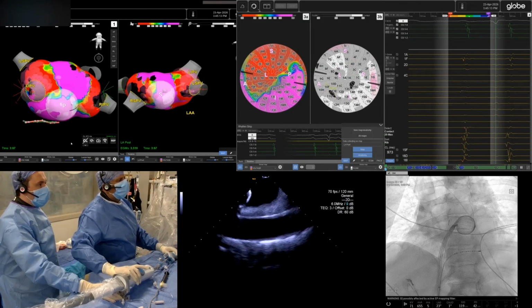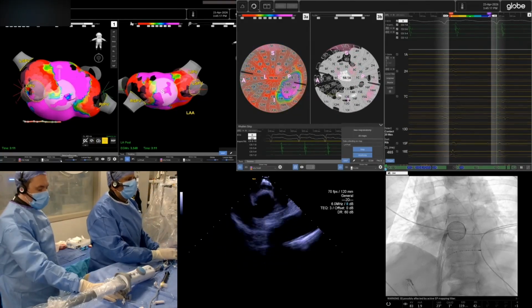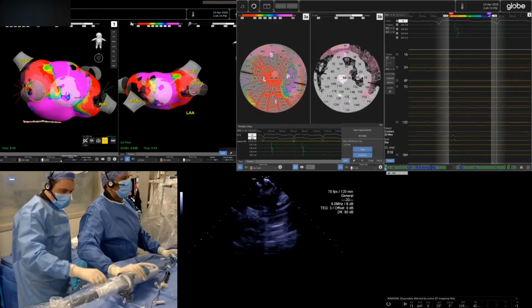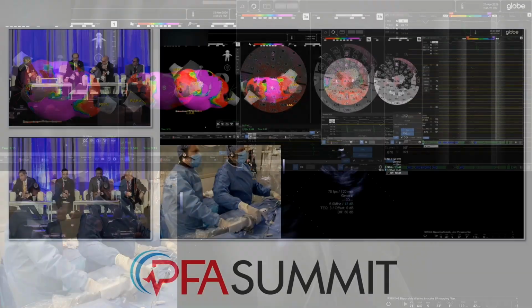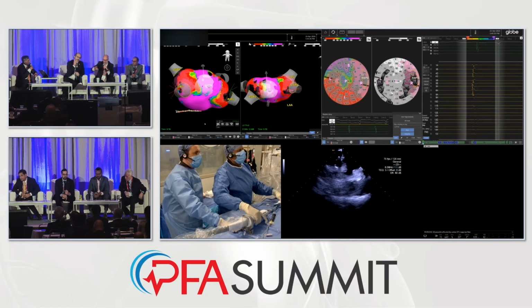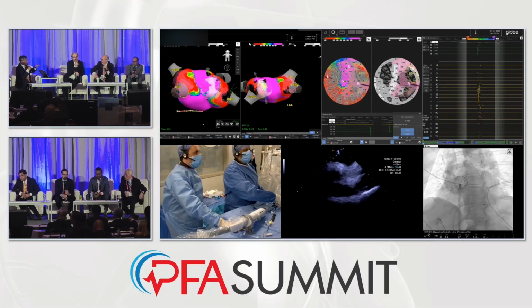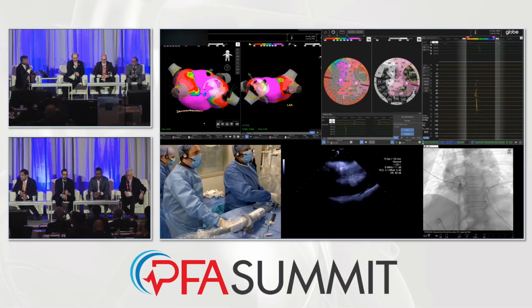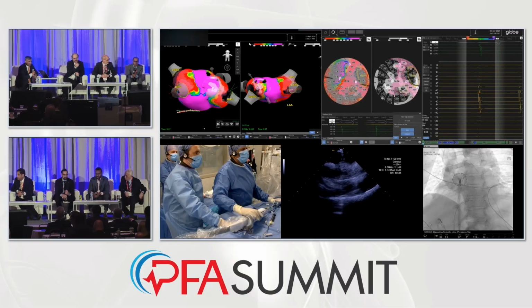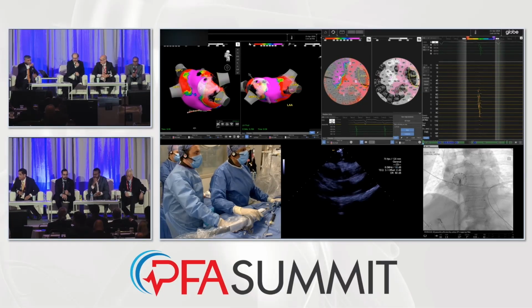When you do these voltage maps, do you do quality control, taking signals only when the electrodes are making contact by the temperature response, or do you just take all the signals? Wait, I'm sorry. When you're mapping now, there's voltage. Oh no, when you're mapping, it's just taking whatever comes. You are seeing the vector go there. You know you're pushing, or? No, the vector is just pointing the direction of that.